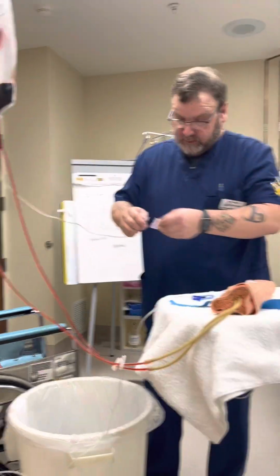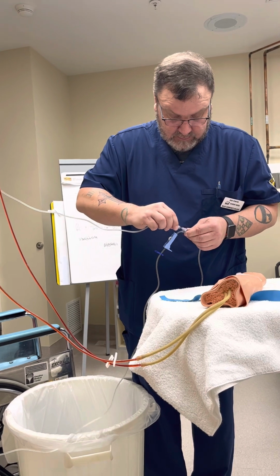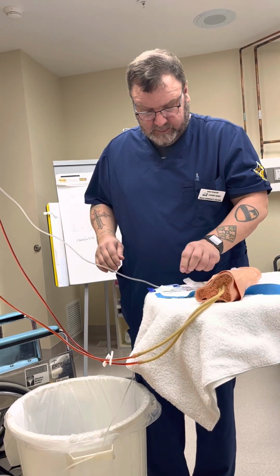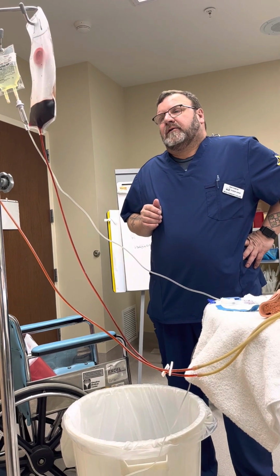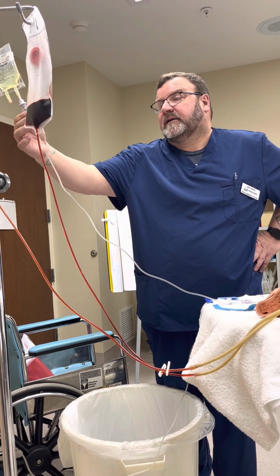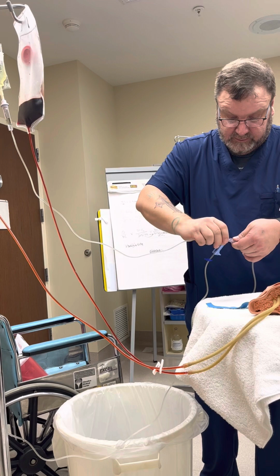I guess we can just clean that, were we to make that error in the real world. And then I can connect this. Now we did the calculations on this, and this needs to go, if I'm correct, I didn't do a great job of priming that. What I should have done was squeeze this to get up to the line. And since I haven't done it, I guess I could properly do this.